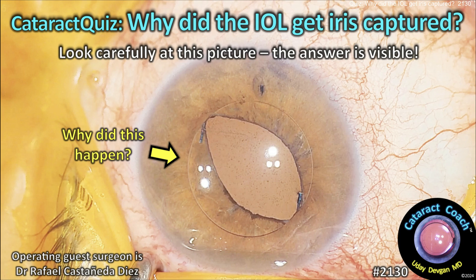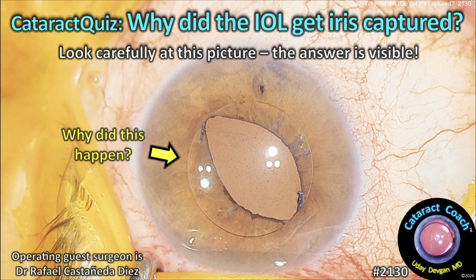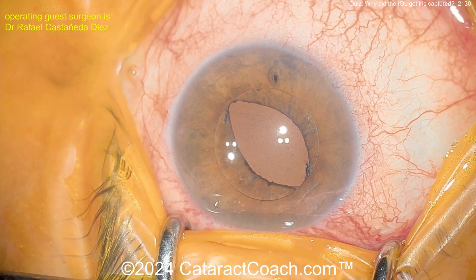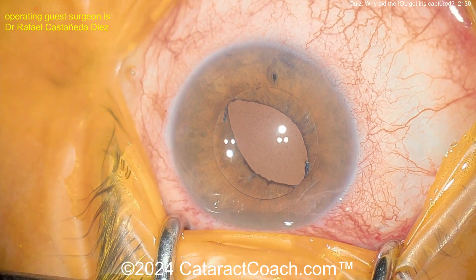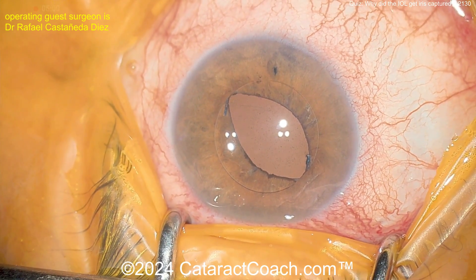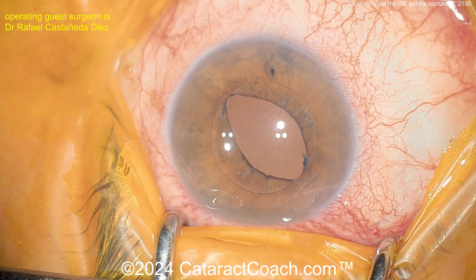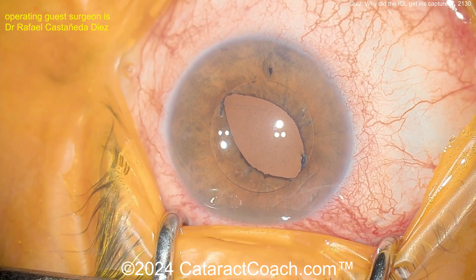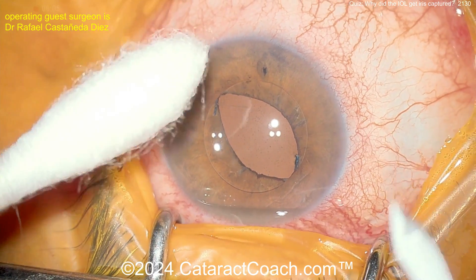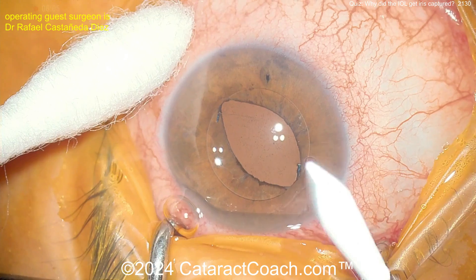Cataractcoach.com cataract quiz: why did this IOL get iris captured? Look carefully at this picture because the answer is visible. Why did this happen? This patient had a sulcus lens placed, and it was placed appropriately in the sulcus, but eventually this lens moved. What do you think?